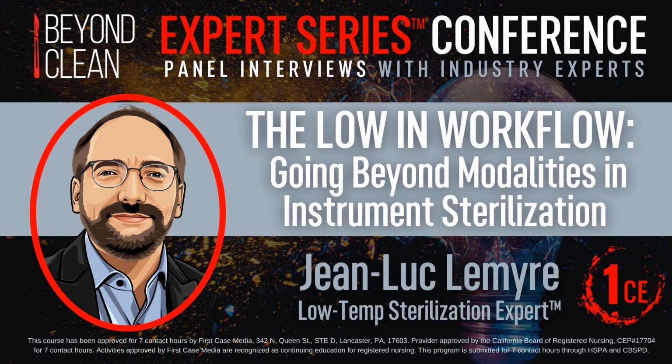I think it can be appropriate, but the same effort needs to go into making sure that the devices that are to be reprocessed in low temp, and even the load configuration if they're to go with other things, are validated and that the device meets the claim of the sterilizer, basically. So it's feasible, but there's some work to make sure that the user doesn't go against the claim of the sterilizer. From steam to peroxide, I'm not seeing any incompatibility in chemicals. I think from going to a different chemical type of sterilization, a user needs to be extra careful that there's no incompatibility from switching from one modality to another.